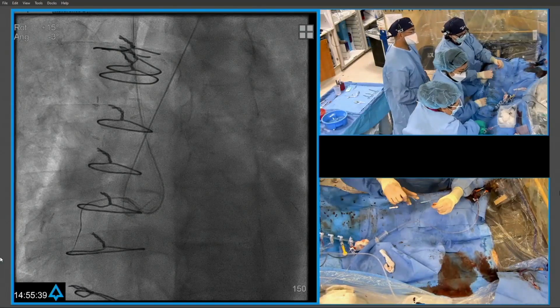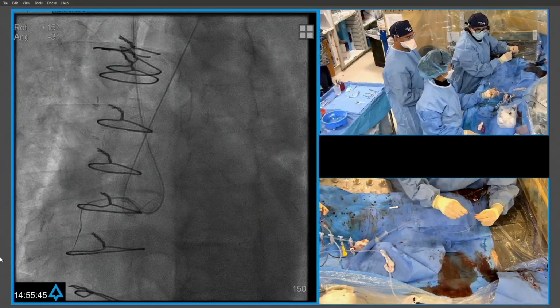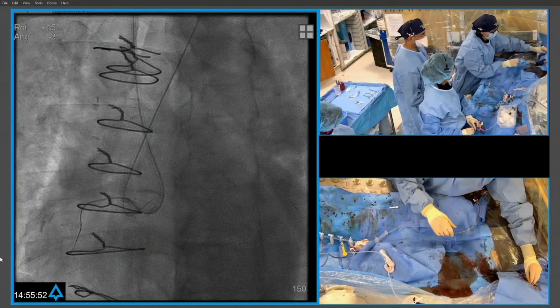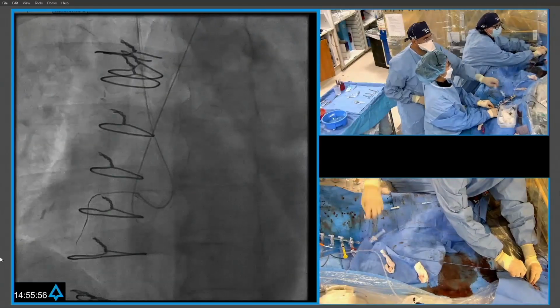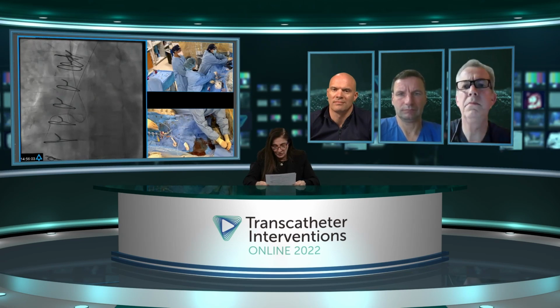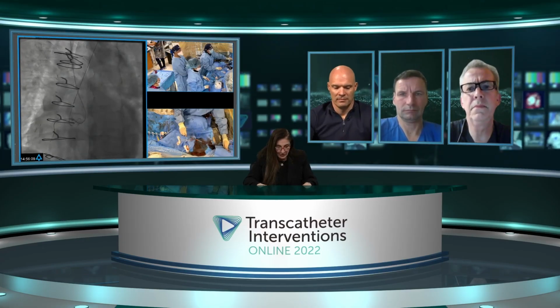And I think the other thing too is that, again, I love this. It's being patient, going through step by step, and we can actually save some pictures at the end, and potentially tomorrow at the start of the course or at some point we can display it from both rooms. Yeah, because that's what I asked for the Erasmus group. I wanted to let you know that we're going to come back to this. Hopefully you'll show us the final results, take films of it, and we really want to see it. I think it will be great to see how you're going to do this.